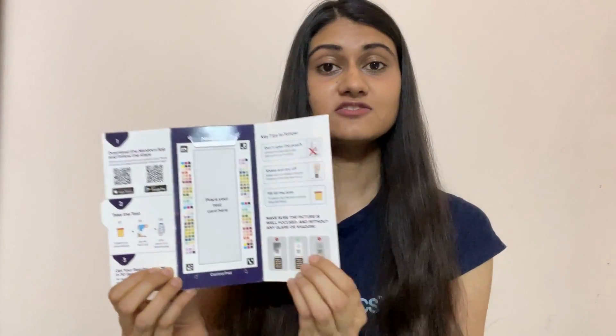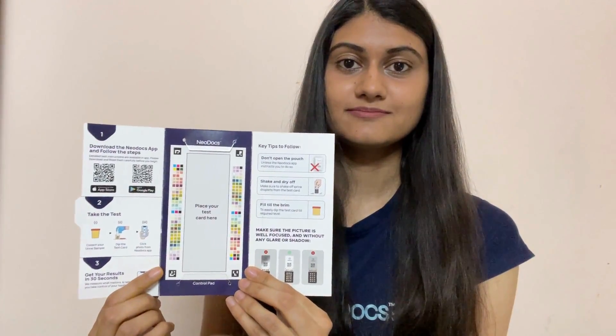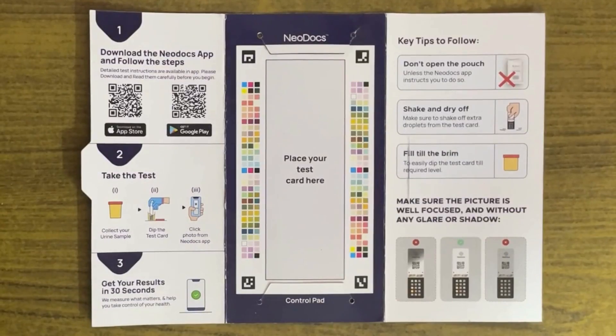Open the Neodocs packaging. Notice this rectangular part with colored squares around it? This is called the control pad. Make sure that the control pad is placed on a plain surface facing the top.